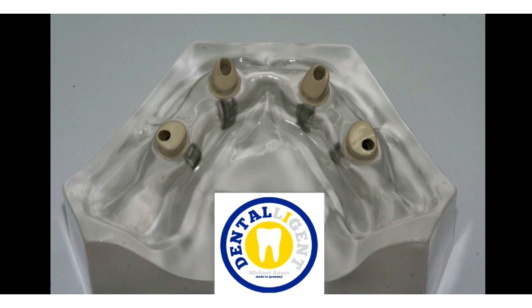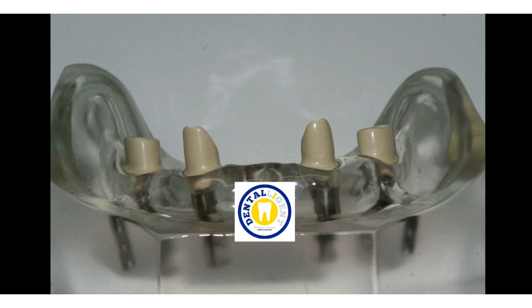The different degrees of the angulated screw channels presented no difficulties here, and a very nice aesthetic and functional design of the emergence profile is very easy to achieve with this material.